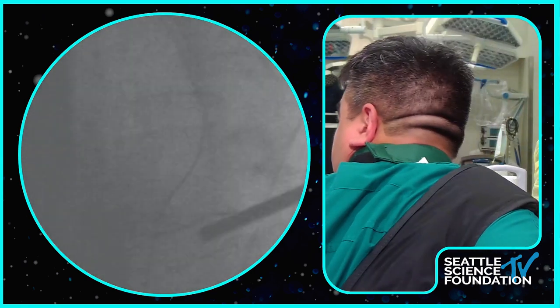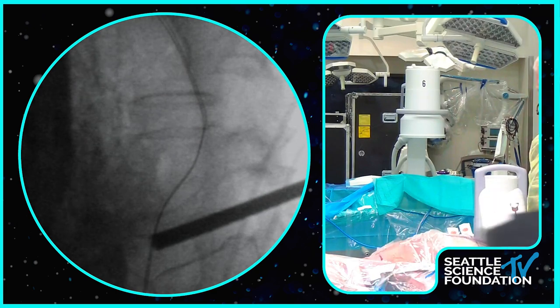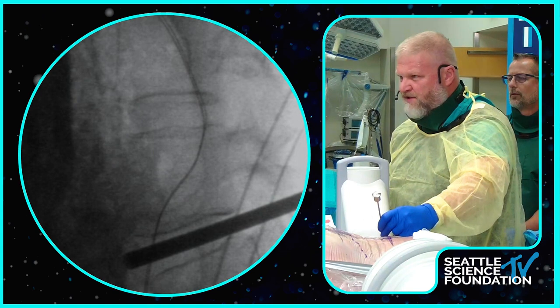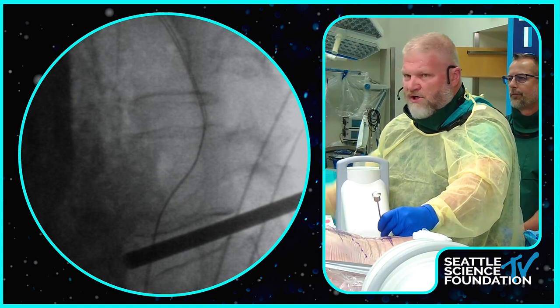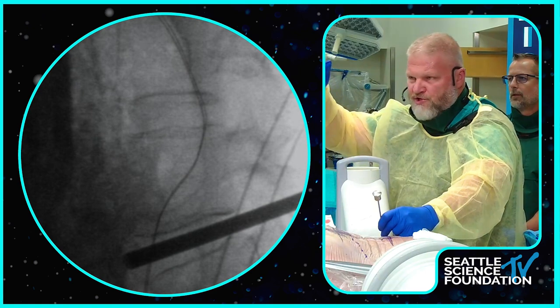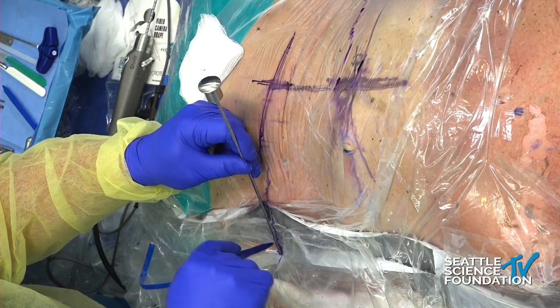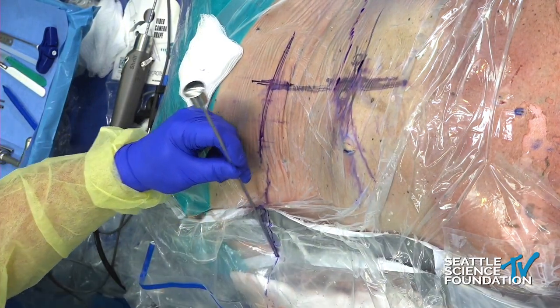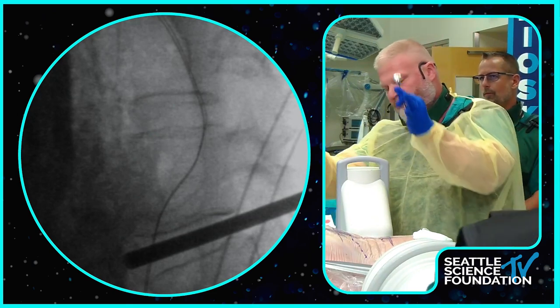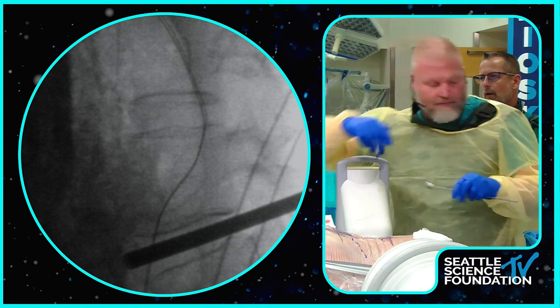Okay. And then under the lateral, what I want to do, one more shot. I want to completely bisect the disc, all the way to the front of the disc space. Can you see that shot? Because you don't want to cheat one end plate versus the other. You want equal excursion to each end plate. Otherwise, you're going to dig into one end plate and you're not going to clear off the other one. So you want this to be dead nuts, split the disc all the way. And then those two lines, we talked about this in the lab, those two lines define a plane, so you can always look at those two lines and visualize the plane of the disc and make sure that you're parallel to that. Go back to AP.